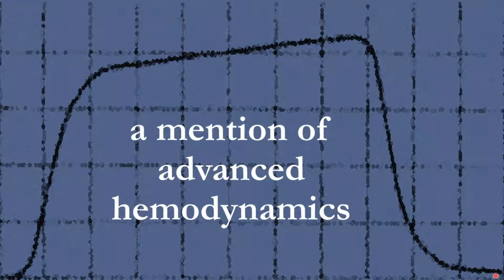The other item that comes up a lot is obviously we talked about end tidal being a surrogate for cardiac output in some ways, and volumetric capnography perhaps more so. But this involves, again, increased complexity for probably marginal benefit. You use a partial rebreathing circuit, which is something I'm not even sure we have available to us. And in the end, I'm not sure how much it's really buying you above the other tools that we have to at least estimate cardiac output. So now that we've talked about all that, let's head back to our case.